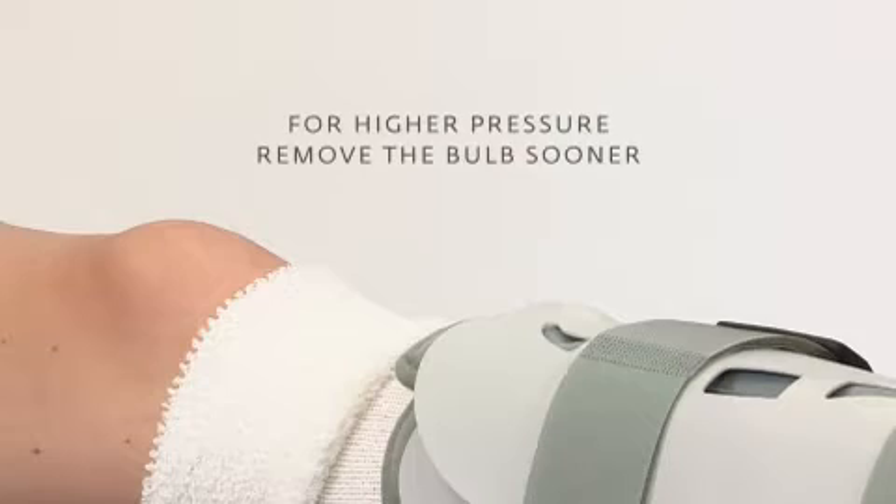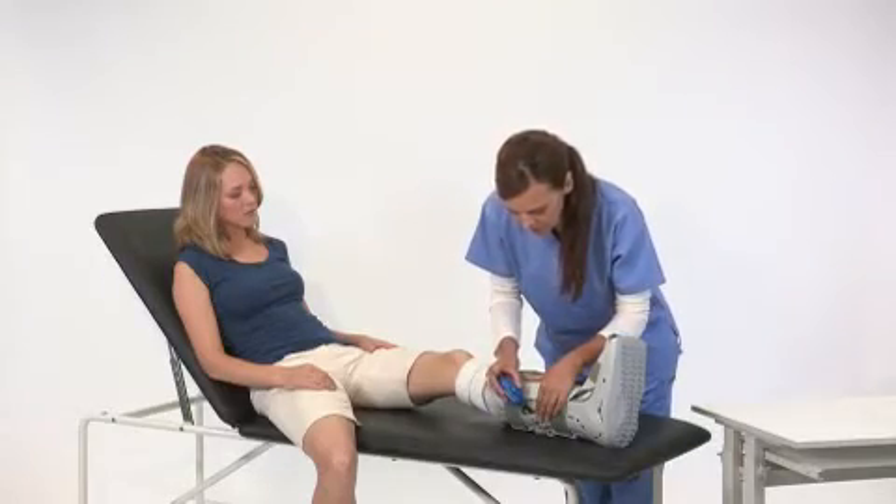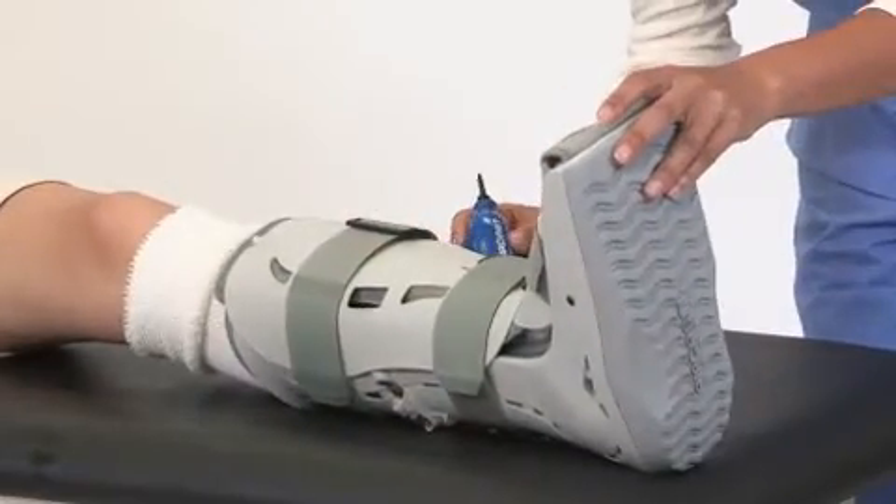For higher pressure, remove the bulb sooner. Next, move to the air cell on the inside of your leg and repeat the previous steps. Then move to the outside of your leg and finally to the air cell on the back of your leg.